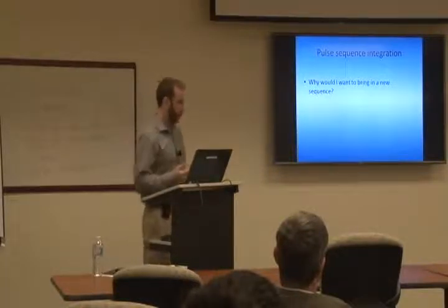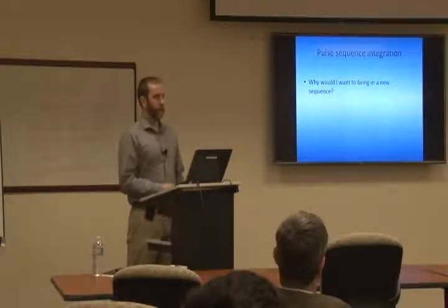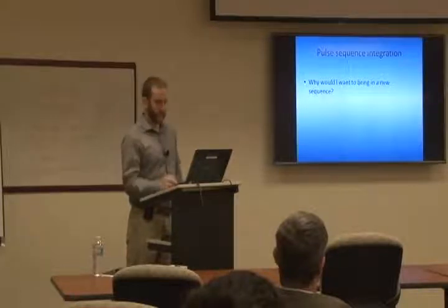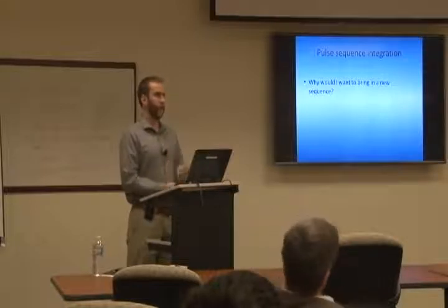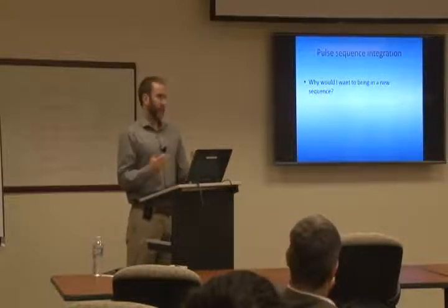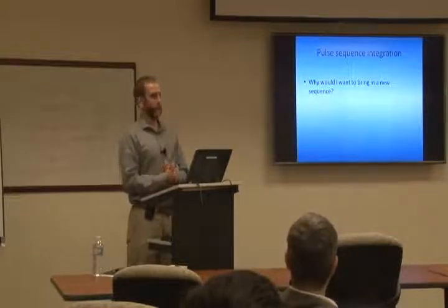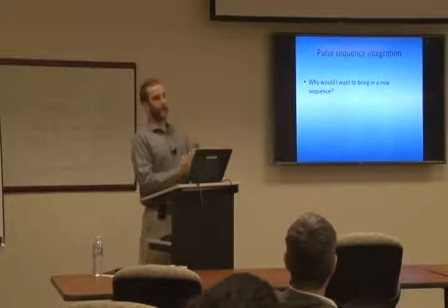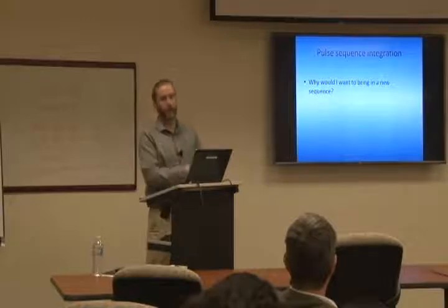New sequences can provide better SNR, better contrast, more reliability, just generally better image quality. There's all different types of sequences you can get. And I've talked about this a few times to a few of you, but I'm a bit of a spectroscopy snob, so if I'm reviewing a paper and I see that you've used the basic spectroscopy sequences, my immediate thought is that you don't know a lot about spectroscopy, and I'm going to be a little bit harder on you because I'm questioning the methodology.